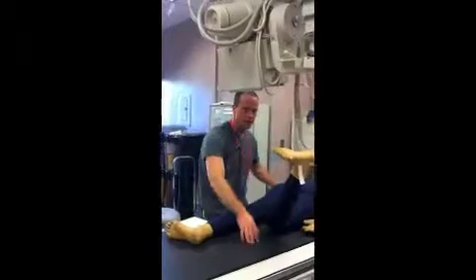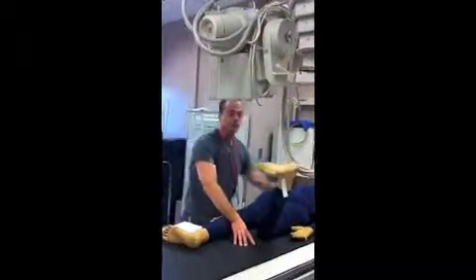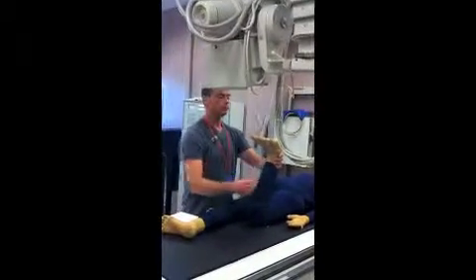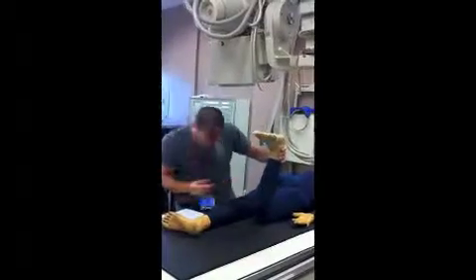We're going to pretend this patient's knee is vertical, because there's just the two of us. The central ray should be entering right about here.